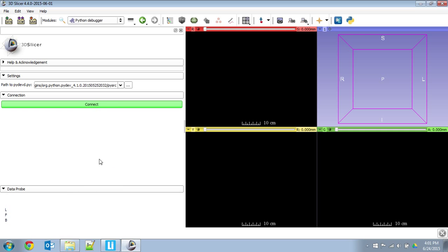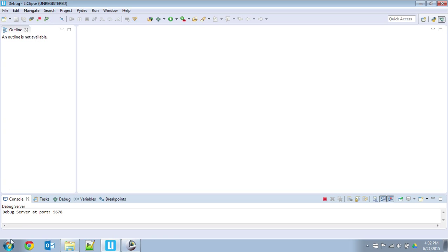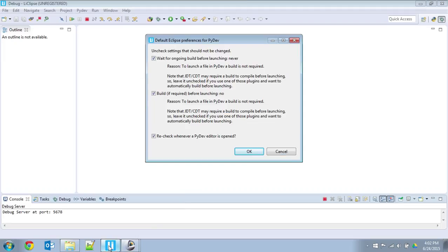Oh wait, sorry, I lied. Go back to LiClipse first. Start the debugging server. You'll see in your console, debug server started. If you hit stop, you'll see terminated, so you want it to be running. And I hit connect. Now Slicer is paused, as it says, until you go back to LiClipse, and you'll get this window. If this is your first time doing it, you'll get these preferences. I'm going to leave the defaults.